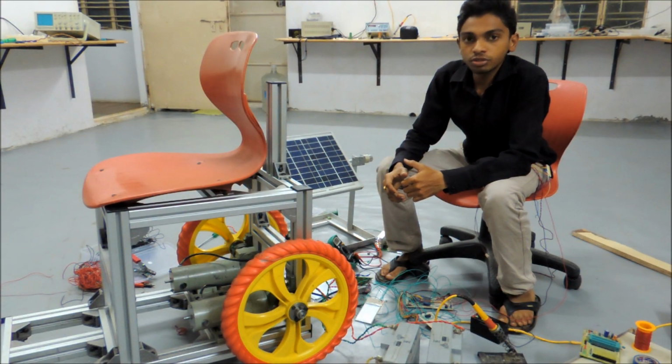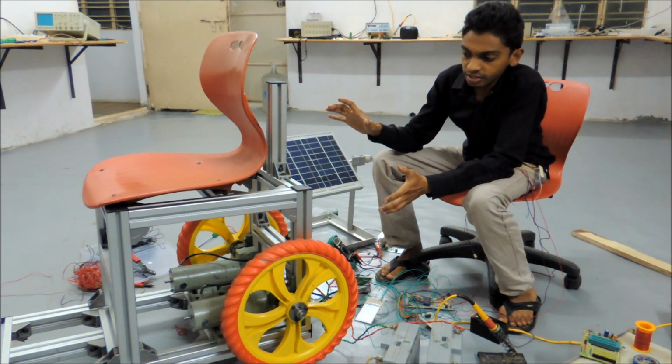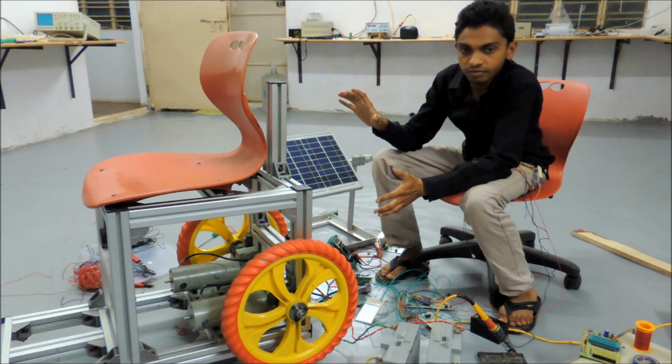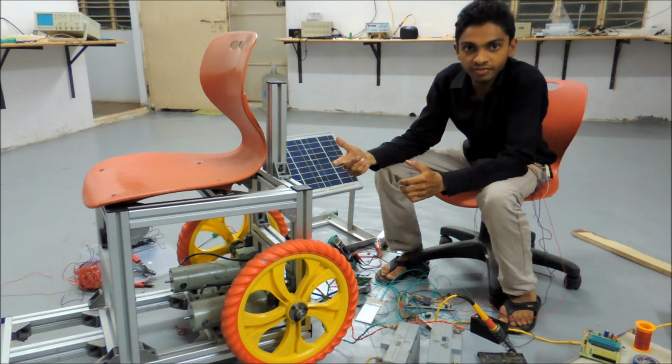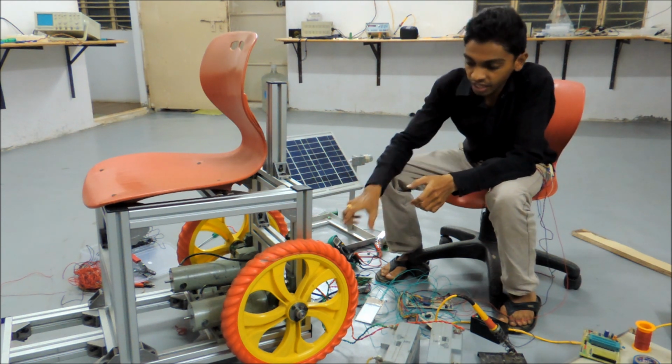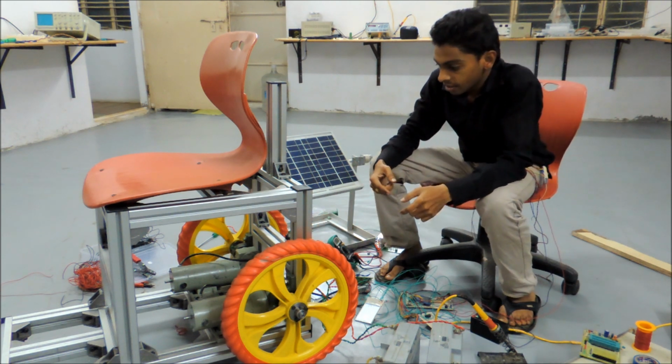So, coming to the introduction of the parts used in our project, firstly the mechanical section. The mechanical section mainly consists of a metallic body which is specially equipped with aluminium material. We have used a caster wheel mechanism to rotate the wheelchair 360 degrees. And we have used a 5.5 inch diameter wheel for free rotation.